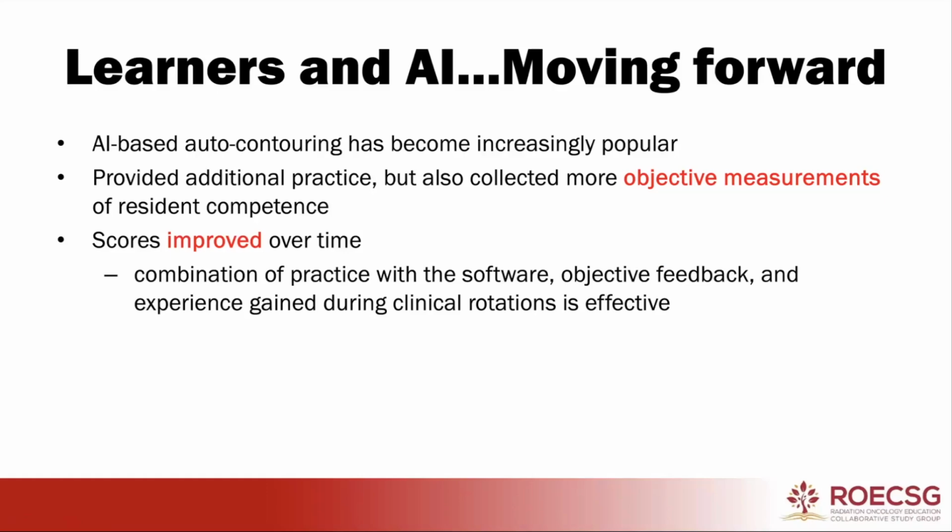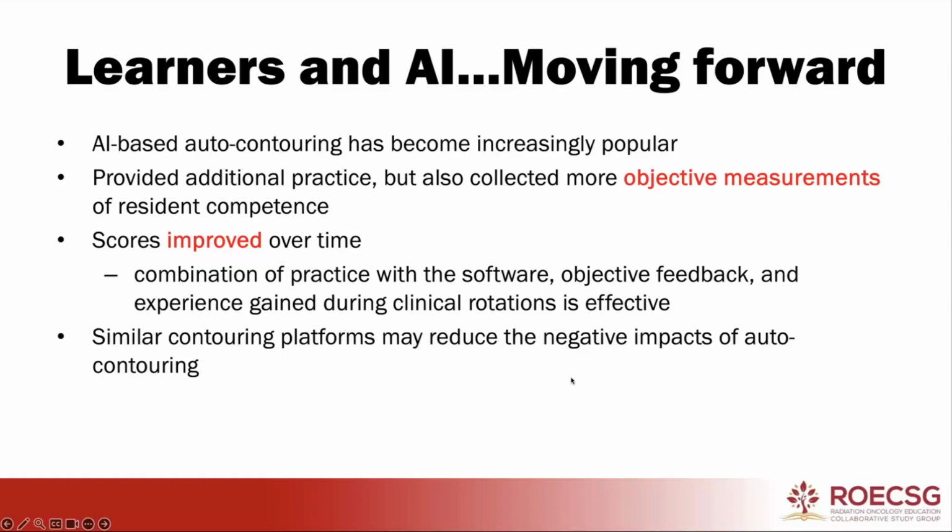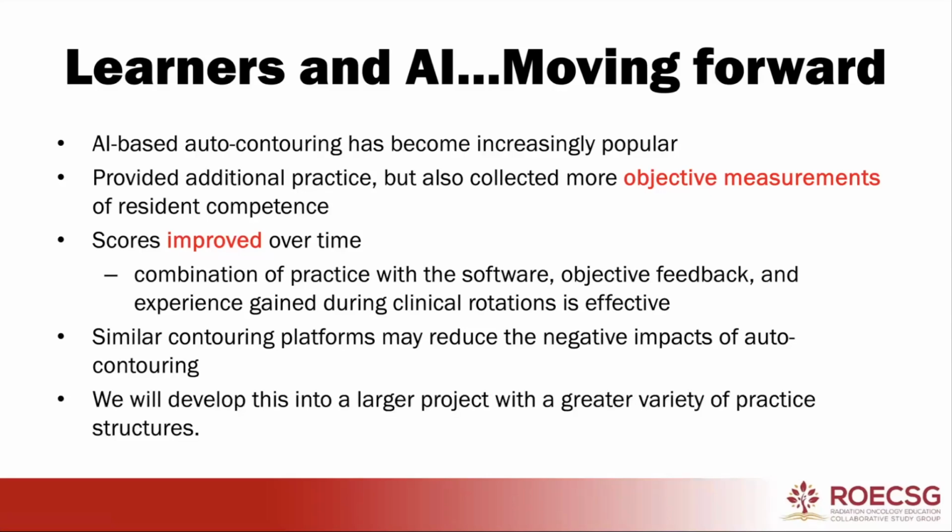So despite something that has not been statistically significant, the scores have improved. Similar platforms may reduce the negative impacts of auto contouring, and we will develop this into a larger project with a greater variety of practice structures, as these are the interim results.